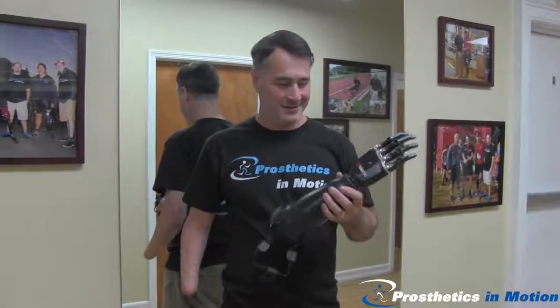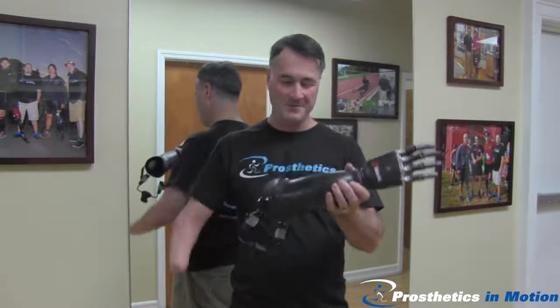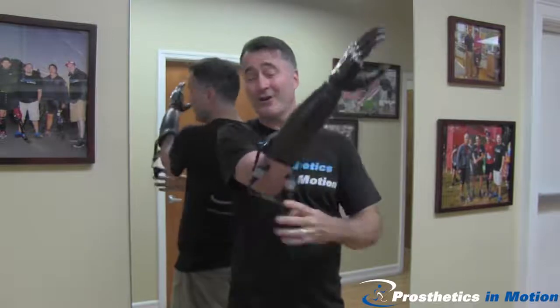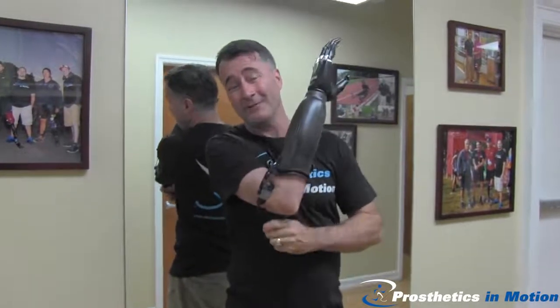I'm here today at Prosthetics in Motion to take home my brand new incredible below elbow prosthetic arm. It is the lightest and most comfortable prosthetic arm I've worn in the 13 years since I'm an amputee.